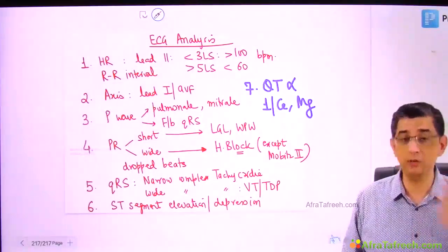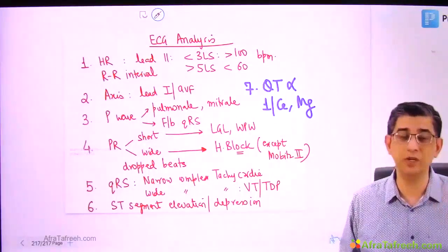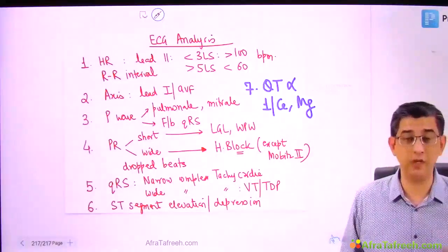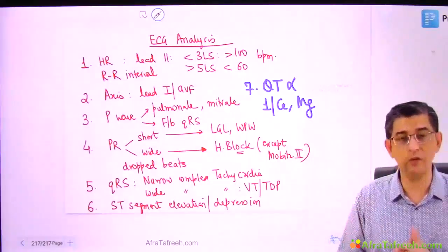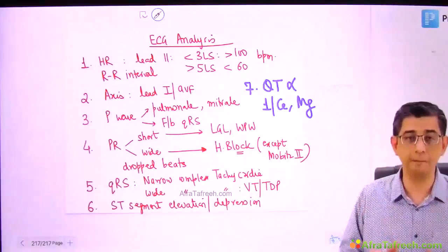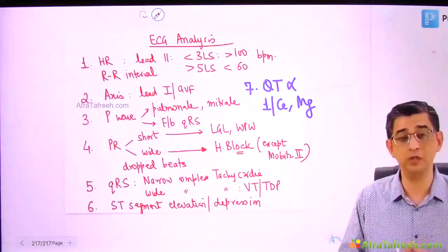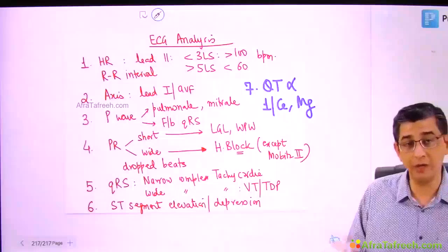And once you do this activity 2 times, I assure you, guys, those technicians and nurses who have been working in the ICU for a long period are able to pick up arrhythmias. They're very, very easy. We doctors all have a phobia of ECG and mathematics, especially that whenever you look at the printout of an ECG, our hands and feet go cold. It used to happen with me in my UG, that yaar ye to hoga hi nahi. But then I gradually realized, कि कैसे नहीं होगा. When I started analyzing, or when I used to see a nurse with 5 years of experience able to analyze, I took it on myself, भाई मुझे भी आना चाहिए, right?